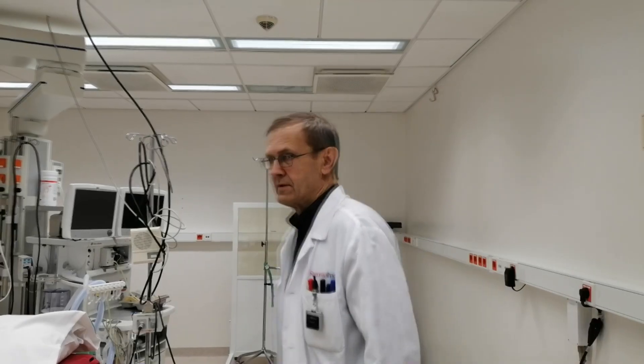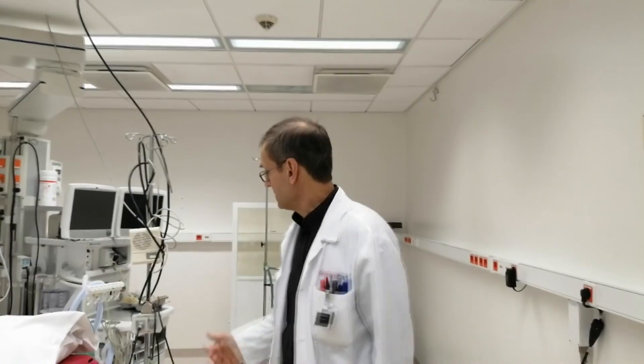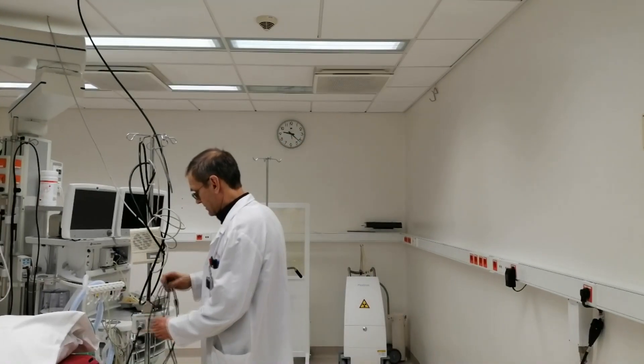Hello to brachytherapy followers. Today we speak about our experience with the in vivo PTW rectum probe 9Y12 in brachytherapy patient treatment.